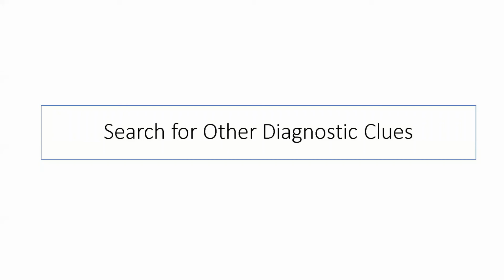Okay, if you know how to assess the architecture fully to put the sentence of architectural distortion, then this is a chronic disease. Then you need to understand as well the other diagnostic clues, which will be the final lecture of these limited seminars, inshallah, next week.